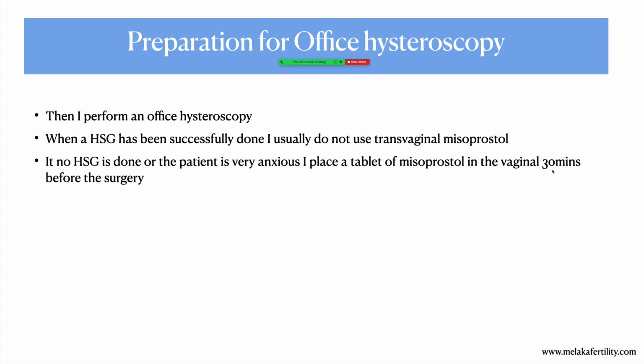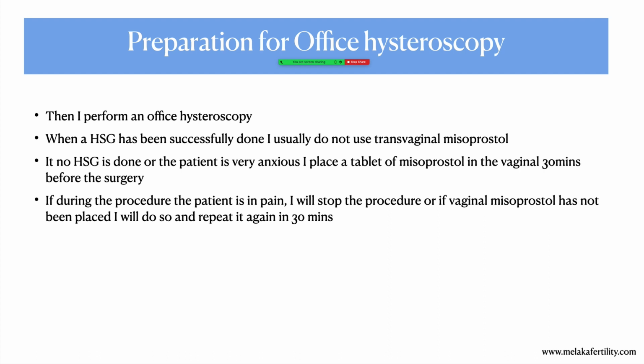And if during the procedure the patient is in pain and I have not put in misoprostol, I'll stop the procedure, put in misoprostol, and then go back 30 minutes later and do the procedure if that can be done. Of course, if it cannot be done, then I'll cancel it and probably do it under general anesthesia.